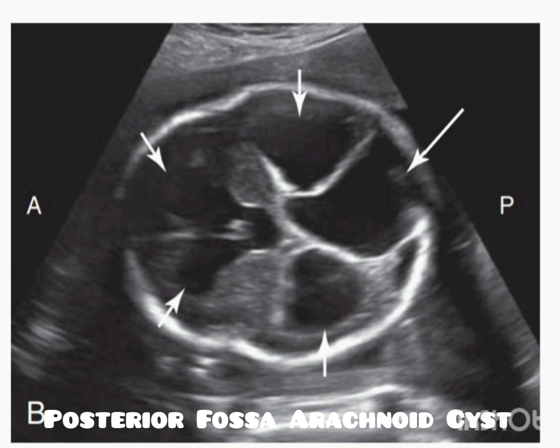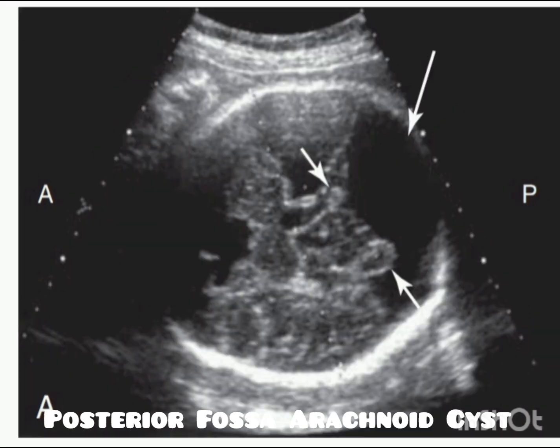In the absence of splaying of the cerebellar hemispheres or vermian defect, mass effect from the cyst can cause hydrocephalus and displacement and compression of the cerebellum, resulting in non-visualization of the cerebellum on antenatal ultrasound. This image is an example of posterior fossa fluid collection — mass effect from the cyst has resulted in hydrocephalus, indicated by the short arrows, and non-visualization of the cerebellum due to displacement and compression.